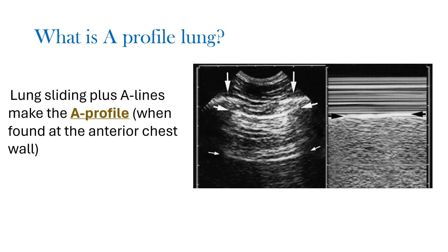A profile of the lung is a normal lung ultrasound in which we see lung sliding — indicated by the seashore sign in M-mode — plus A lines. When lung sliding plus A lines is present, we report the lung ultrasound as A profile. This is recorded at the upper and lower BLUE points. We report at each point: BLUE point 1, BLUE point 2, and the PLAPS point.